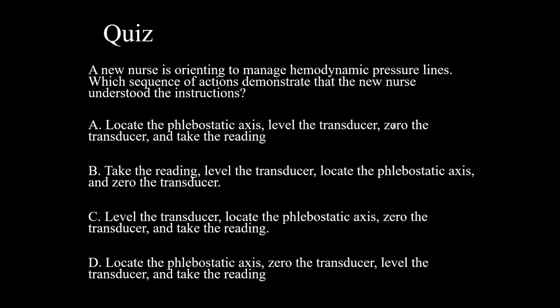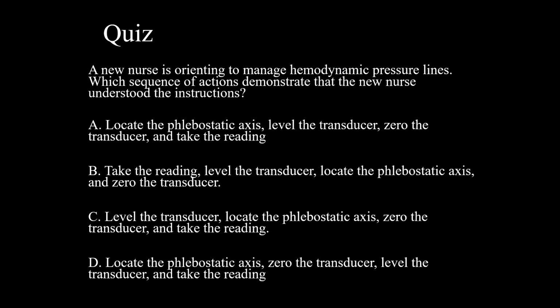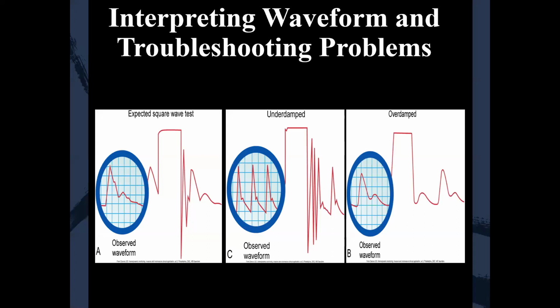Dr. Comer, I have a question. Sure. Like the last one, how you said the overdamped, how you have to troubleshoot it and figure out what's causing that. Is there a way to troubleshoot the underdamped or no? You really should. Yes. Honestly, I can't think of a time that I've seen the underdamped. It's more often than not that I have an empty bag, air in my line, or the patient's kinked that I see the overdamped. I'm not going to lie, it's more often I've seen the overdamped than the underdamped. But you need to troubleshoot both because it shouldn't be either. Does that help? Yep, thank you.